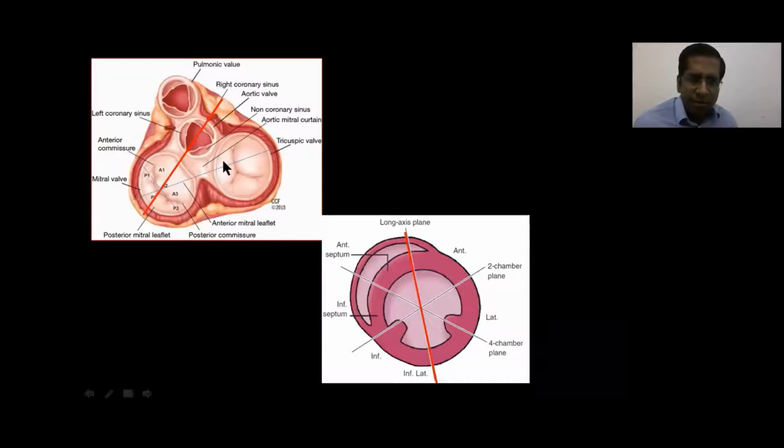So in a normal individual, without any anatomic distortions or enlargement of the right-sided chambers, if you start seeing a tricuspid valve or a part of its supporting apparatus, then that means that you are more towards the tricuspid valve. You're more towards the right side. On the other hand, sometimes you may see the pulmonary valve also in the parasternal long axis view, in which case you may need to align it by slightly rotating counterclockwise so that you get a proper parasternal long axis view.